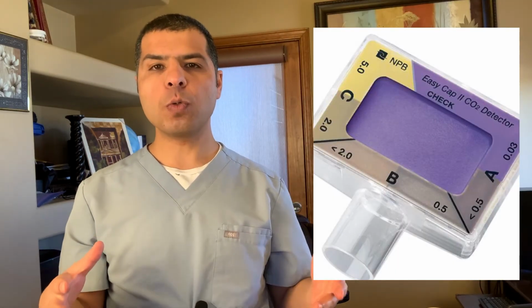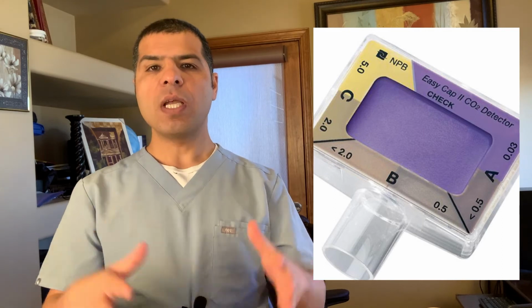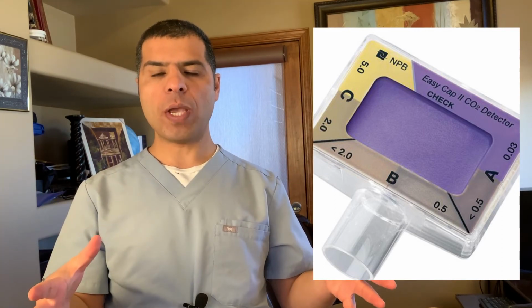And that's one of the tools that you need to have. It's the most accurate way to verify where your ET tube is. Despite the fact that I saw it going through the vocal cord, I need to make sure I did not go into the esophagus for one reason or another, right? Very important to do that.